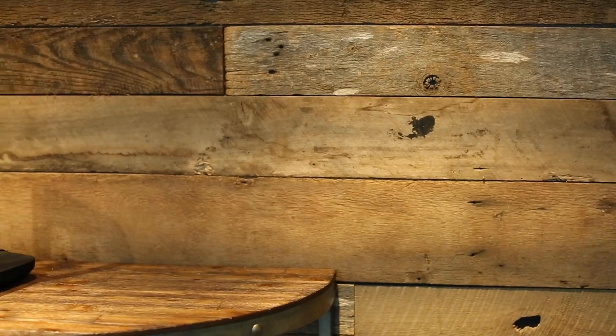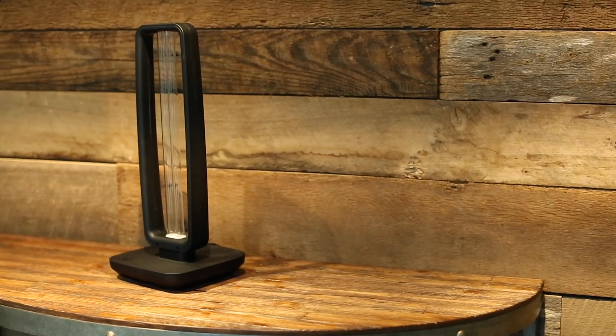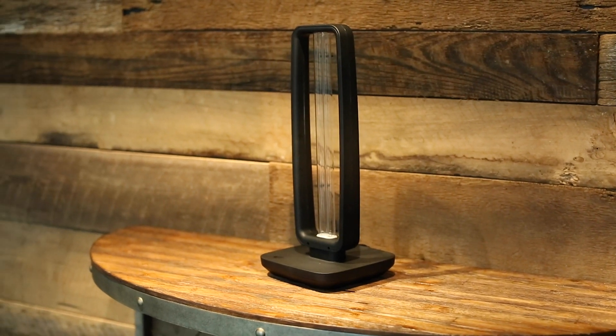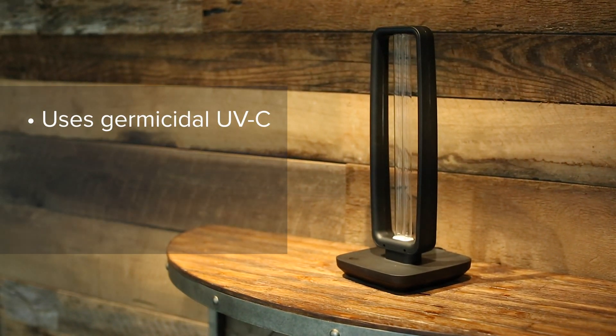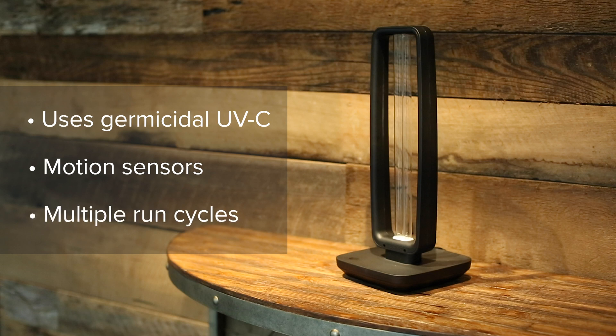Hi, this is Andrew from Regency Lighting. Today we're going to take a look at a new ultraviolet germicidal fixture. This is a tabletop or desktop unit that can be used to disinfect surfaces with UVC light. This unit includes a motion sensor to auto cut off if someone is sensed in the room, because ultraviolet light is harmful for our skin and eyes, and it also has a couple of different run cycles.